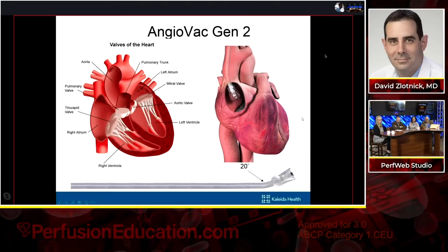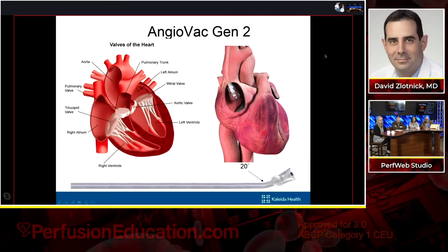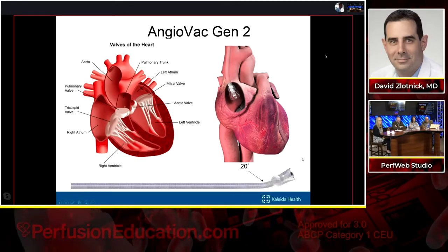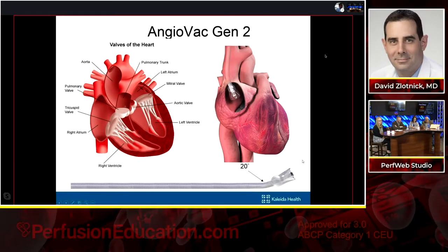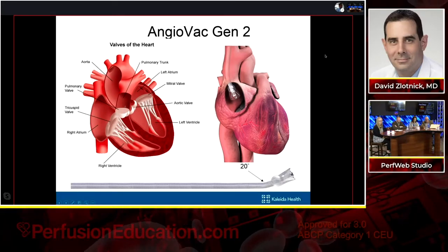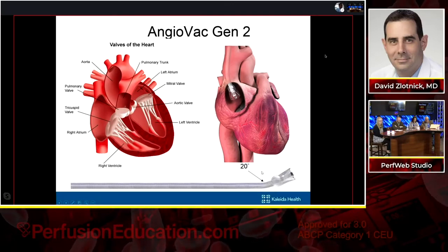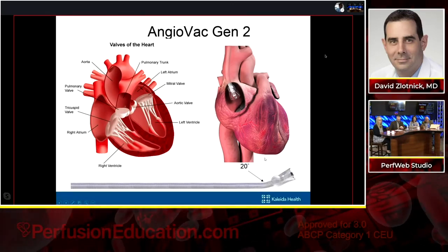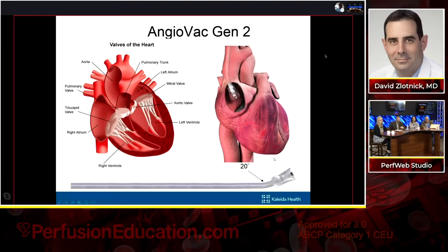So we had to figure out ways that we could make this do what we want or go where we want it to go. And so two different techniques were developed. One was where we basically put a suture in at the tip funnel, and then that suture would be externalized, and as you pulled that suture, that would pull the AngioVac and give it more of a 90-degree bend.